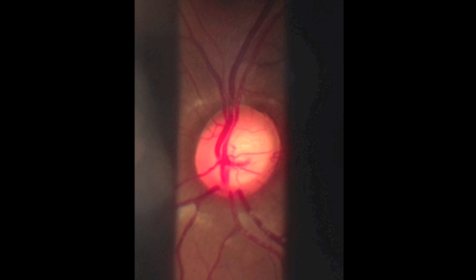Because the image is inverted and laterally reversed, you must be especially careful in recording your findings. An easy way to do this is to rotate your paper through 180 degrees and draw exactly what you see.